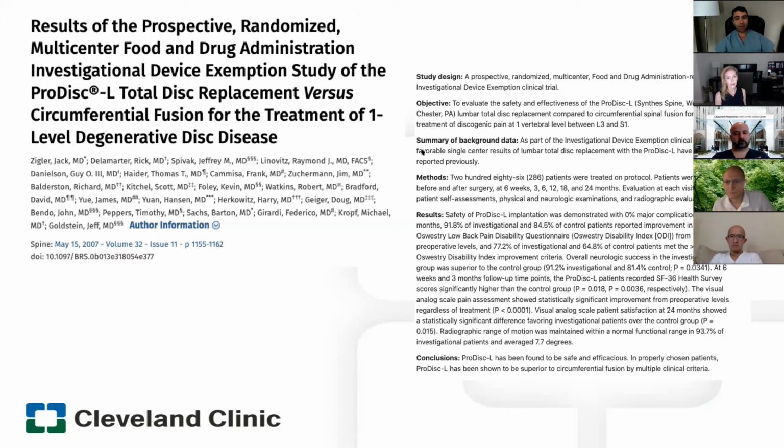And there was a high reliance on the visual analog scale, the VAS, which is probably the most rudimentary of all the patient-reported outcome instruments, right? Because now you have much better ones. You have PROMIS scores. There's so many better ones out there, but these are the most basic of the basic, okay? So those are the things they found and deemed a positive result. Just keep that in mind.